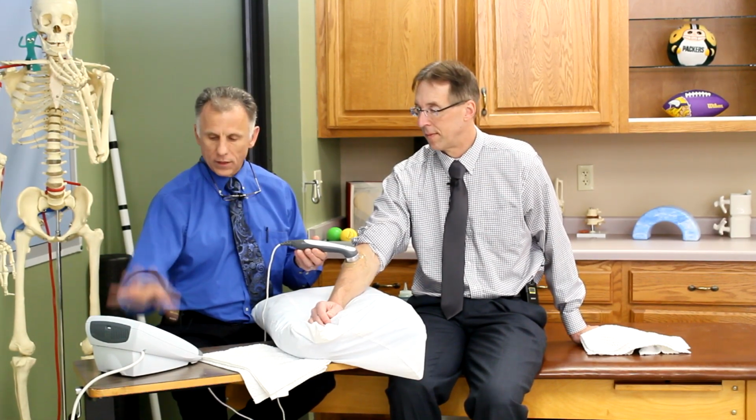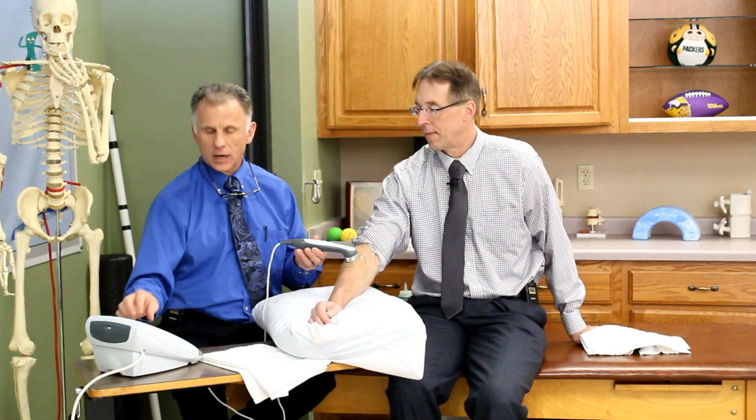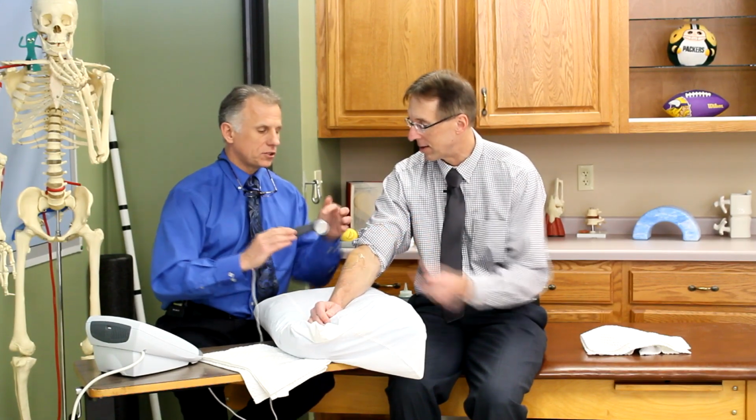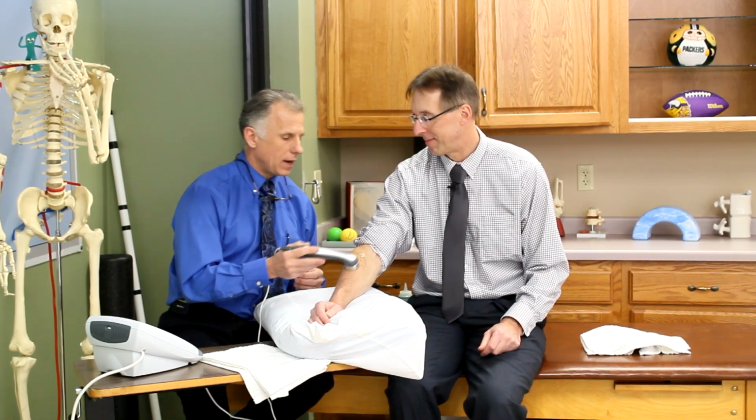And you're going to set up for how much heat you're going to have on it. Now, with our units, a professional unit, there'll be a gauge on it, or a digital reading, that tells you how many watts per centimeter squared. A home unit, from what I could find on the ones I looked at, is just rated in watts, which is a big difference from watts per centimeter squared, because per centimeter squared is the surface area of the face of the head. I usually never go over 2 watts per centimeter squared. I'm usually around 1.5, or 1. If you buy one, they may say it goes up to 10 watts of power, which may not be very much at all, depending on the size of the head.